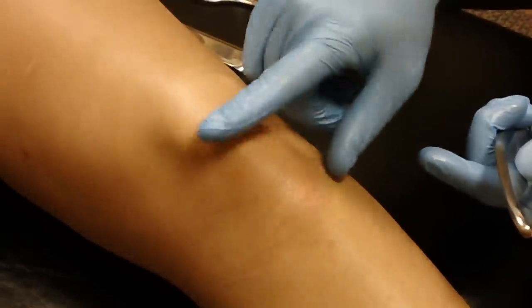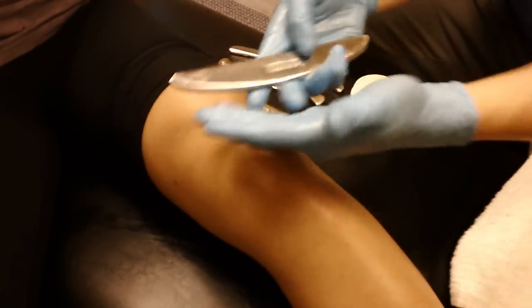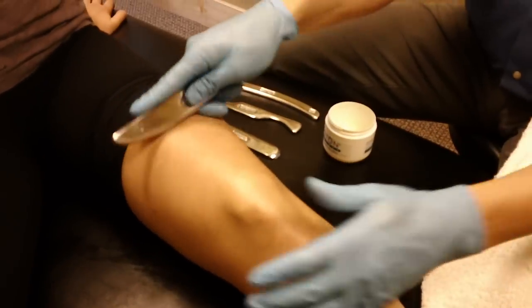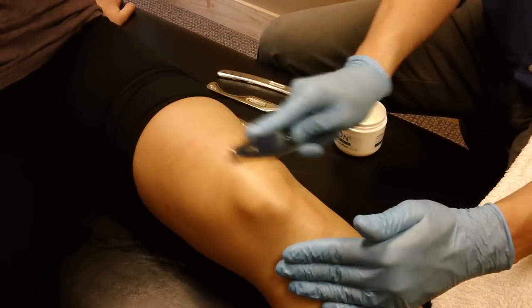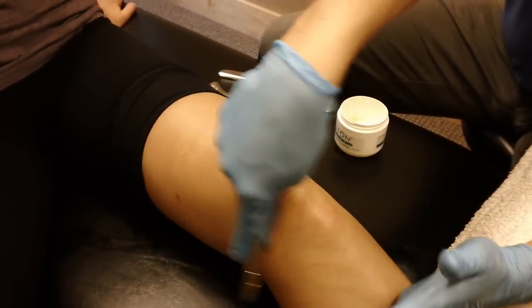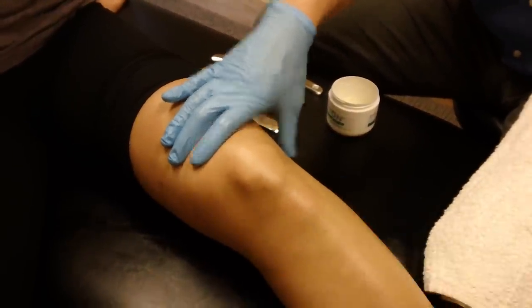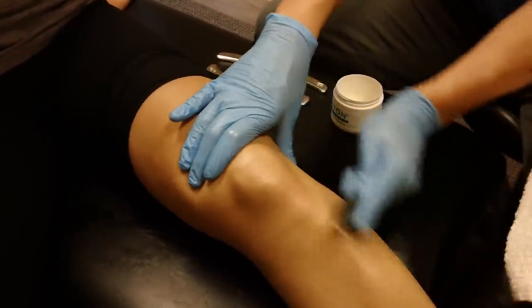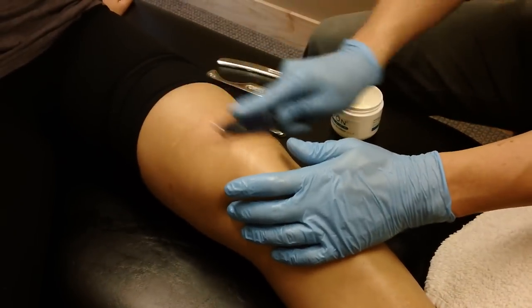So we'll want to work right around and in that area, but not before we warm up and work some of the adhesions out of the quadricep muscle. I'm using what we like to call the GT4, and this is probably the instrument I use the most with Graston Technique in general — very good at getting in and scanning through. Some practitioners like to call this the scanner because it's great for finding the areas that have the most adhesions or restrictions.